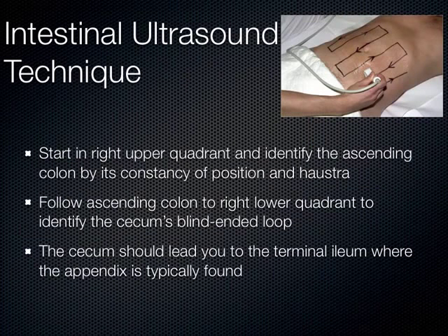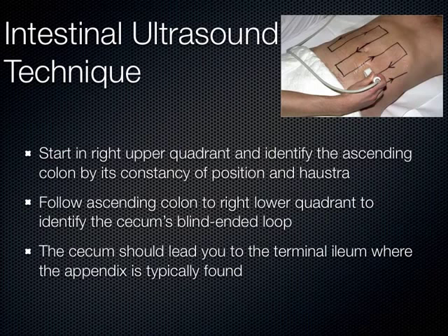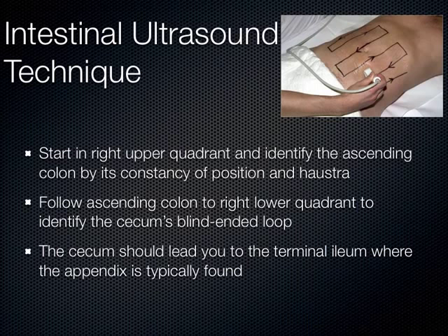What we do is this technique called mowing the lawn, where you start in the right upper quadrant and you can see the ascending colon there. The ascending colon is always in the right upper quadrant — it's got haustra. You can identify that on ultrasound when it's filled with fluid. You follow that ascending colon down to the right lower quadrant, and that's where you expect to see the cecum with its blind-ended loop, which brings you to the terminal ileum where the appendix juts off.